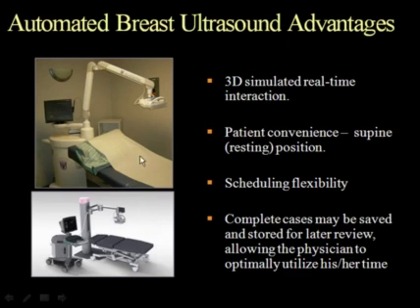Here is what the ultrasound unit looks like. The patient's lying here. The probe will come down and the technologist will hold it on top of the patient's breast. Here is the unit. You can actually see your images right there. You're able to do 3D simulated real-time interaction. Patient convenience here for sure because they're resting.